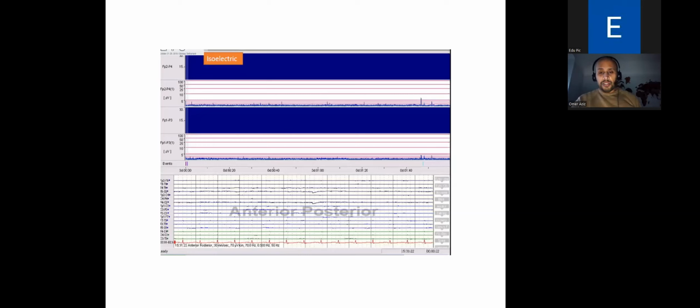Again, this is an isoelectric EEG. If you're on a massive amount of sedation, you might be achieving this, for example, if you're on a significant amount of thiopentone, but also if you've got significant impairment of the brain, say, for example, from a significant prolonged downtime in an out-of-hospital cardiac arrest. As someone already mentioned, someone who might be dead by neurological criteria might have a completely flat EEG. So it's again using this to provide some context to the clinical picture.